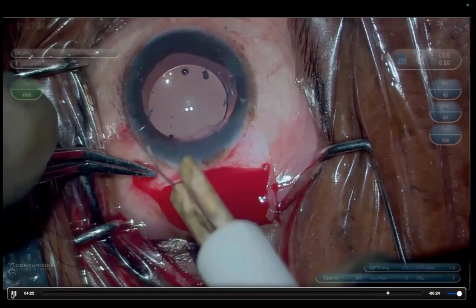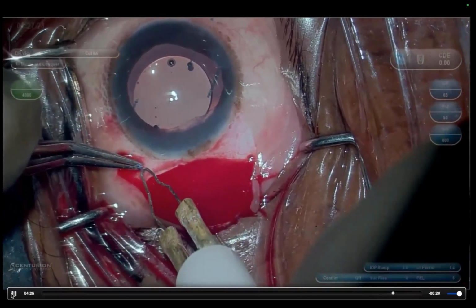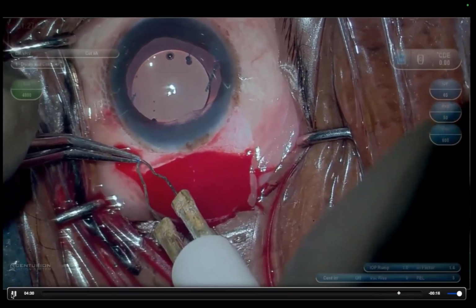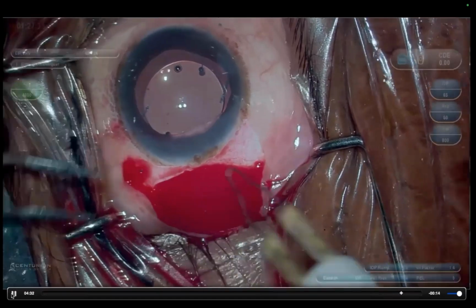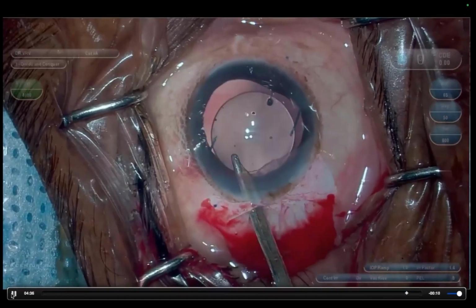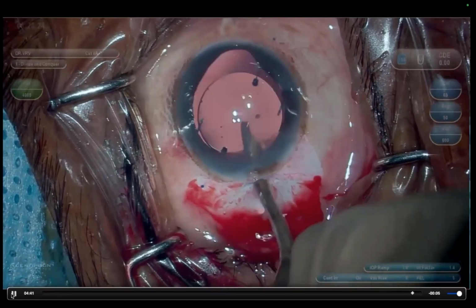Most important thing while doing this procedure is the surrounding has to be really dry. If the suture is wet or the surrounding is wet, the flanging might take a lot of time. So that's, you can see the time taken. That is because the surrounding area is very wet. And then, all you have to do is form the anterior chamber firmly.